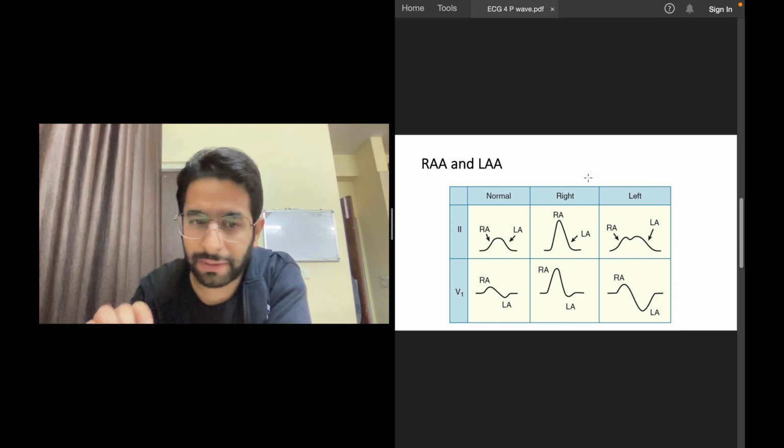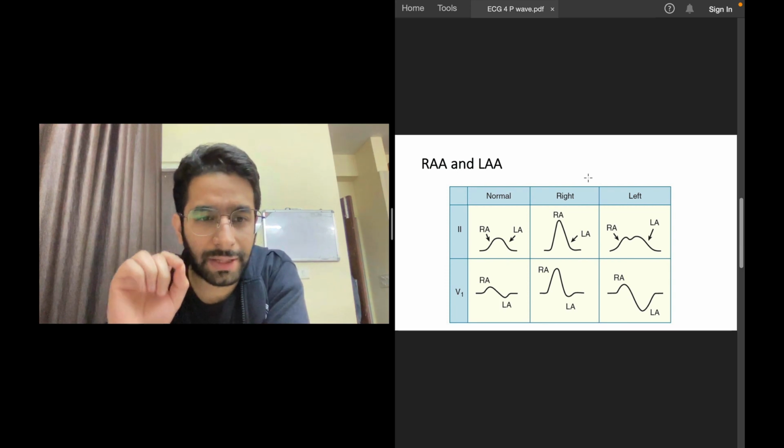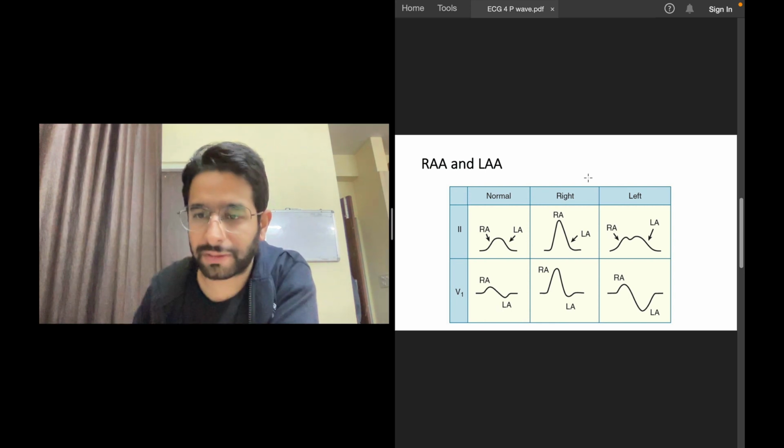See, ECG is about pattern recognition. And this is why I've created this tutorial, that I tell you what these important patterns are so that you watch these videos maybe multiple times and remember it. It's just about pattern recognition.